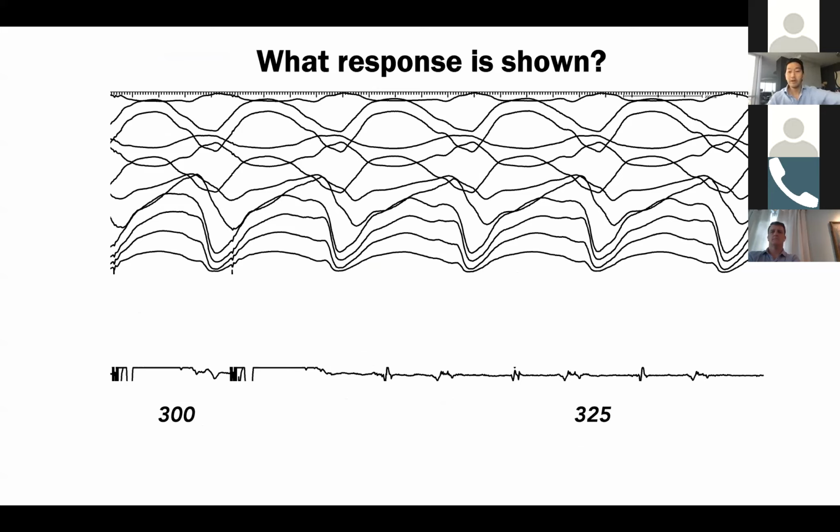So here, and I think we'll conclude with this tracing, I'm giving you one channel. How do I know I got multiple components? I've got here, and I've got this one. Well, again, I need to look to see if I capture this one, my stim should be inside the QRS. If I capture this one, my stim should be somewhere here before the peak of the T wave. Well, my stim here is way before the T wave. So I might not be capturing any of those directly. So then you start thinking about a bystander situation.